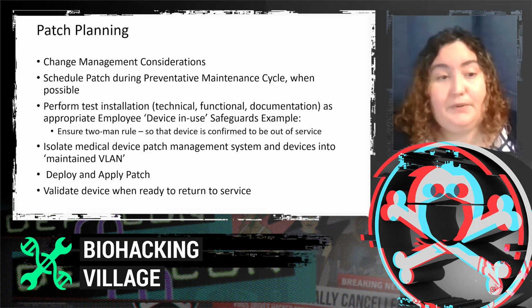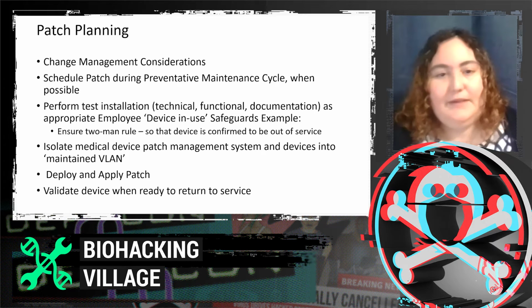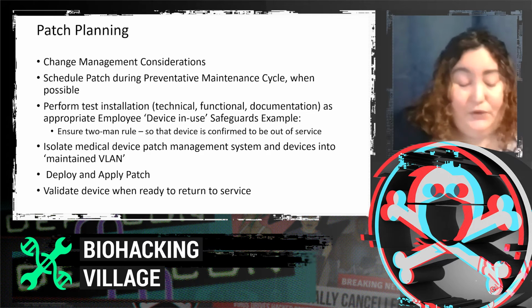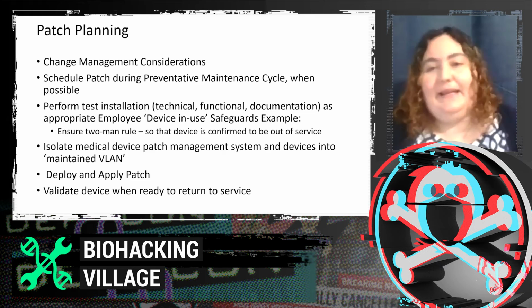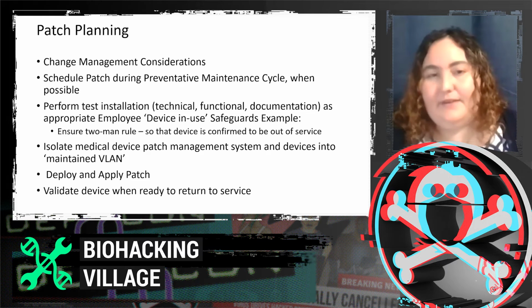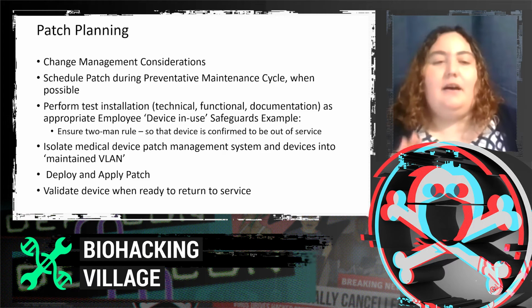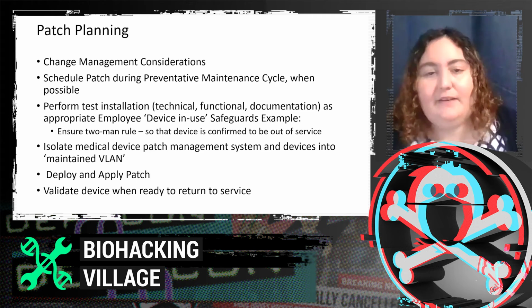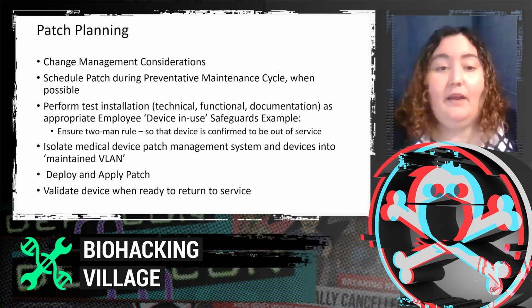When possible, employ device in use safeguards, the two-man rule. So, hey, I'm going to patch this MRI machine. Can you see it? Can you verify that this is actually empty and not in use? Because we have it on the schedule that it's not in use today. Yes, I'm looking at it. There's nobody in it, and there's no plan to use it today. You're going to want to isolate the medical device on a maintenance VLAN and then deploy. When everything is back up and running, return it to service.